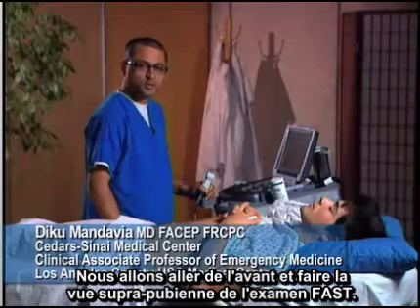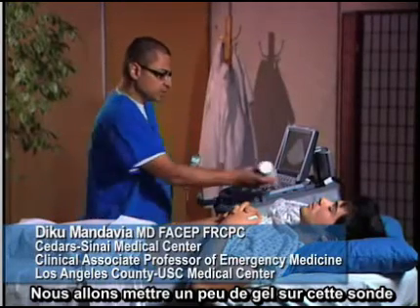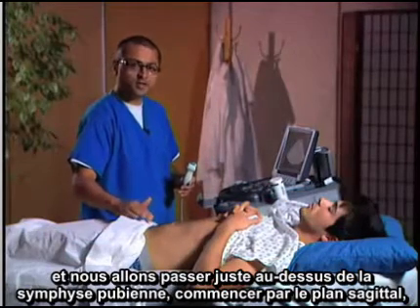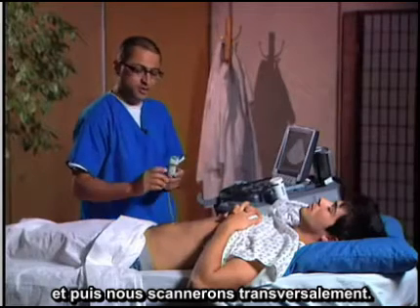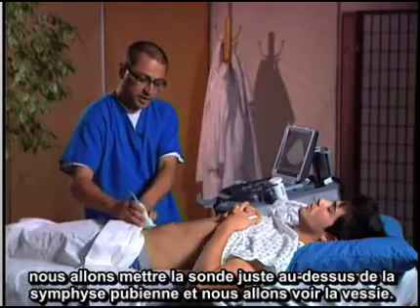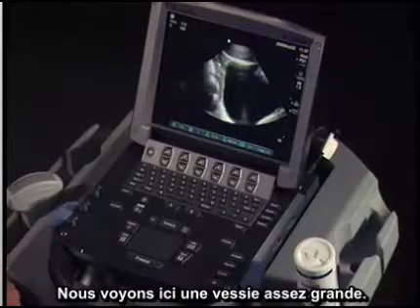We're going to go ahead and do the suprapubic view of the FAST exam. We're going to put a little gel on this transducer and we're going to go just above the symphysis pubis, starting initially sagittally and then scanning transversely. Our marker is aiming toward the patient's head and we're going to put this transducer just above the symphysis pubis and we're going to see the bladder.